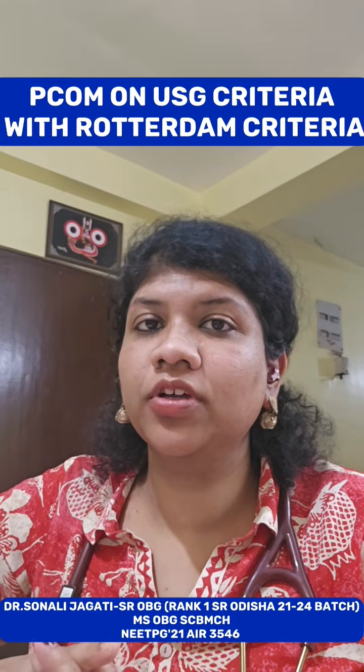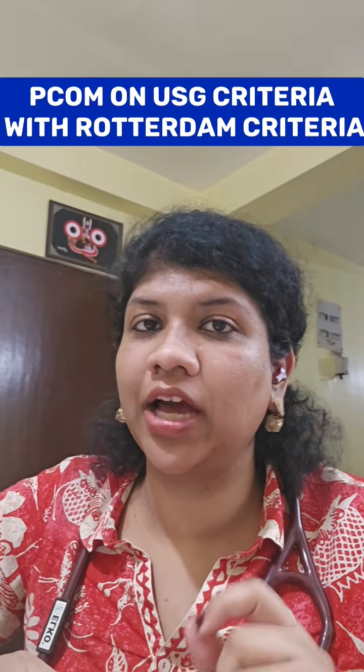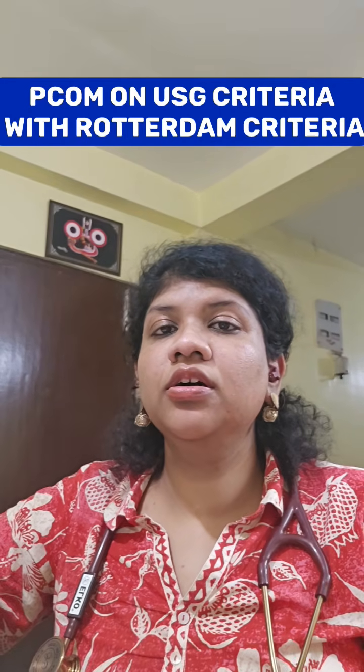Now, this is one of the three parameters given by the Rotterdam criteria for diagnosis of PCOS. So, in the ultrasound, it is important to remember some key points. First is that they advise us to use transvaginal ultrasound rather than transabdominal ultrasound. So, TVS is better than TAS. Also, they have told that you should use a TVS transducer with a frequency bandwidth which includes 8 megahertz.